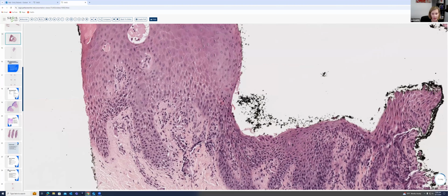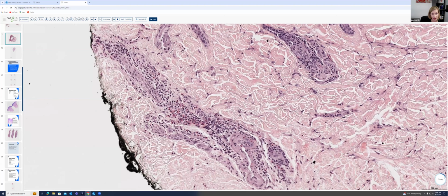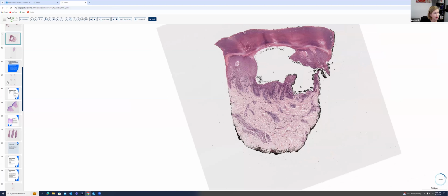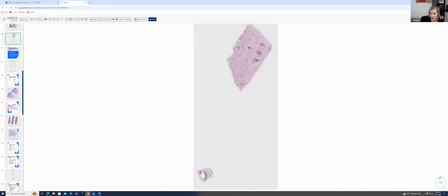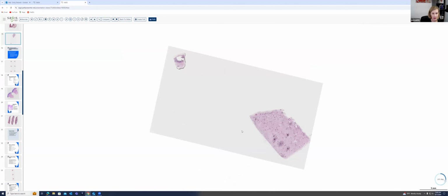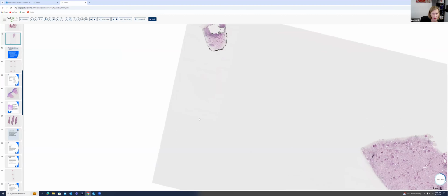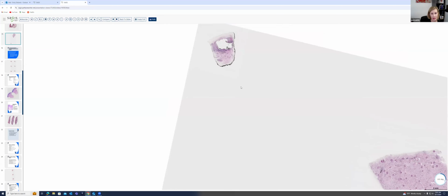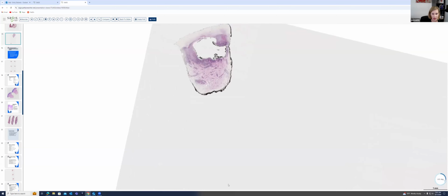And then as we evaluate the deeper dermis, we actually see lots of eosinophils in a predominantly perivascular pattern. And then our next slide, whenever we are evaluating spongiotic dermatitis, we always perform a PAS stain. A dermatophyte infection will always be in the differential diagnosis for spongiotic reactions and can sometimes be surprising clinically and histologically.